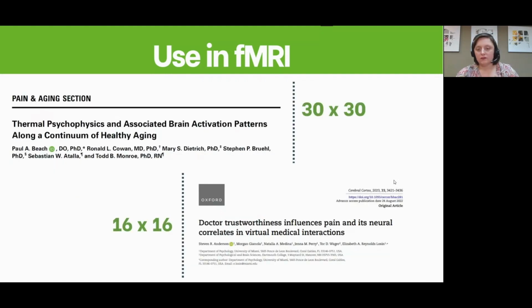And then there are examples of two other options of thermode that you can use inside the MRI scanner. 30 by 30 was used in this paper on older healthy subjects to see how the age influences the pain perception and sensory perception, how it is showed on the fMRI scan.